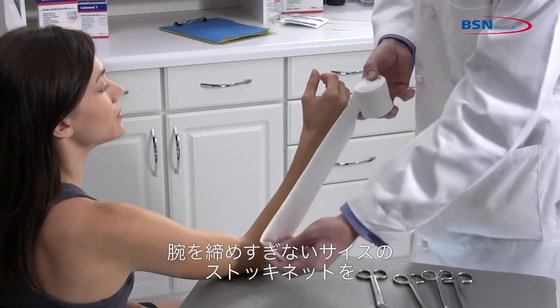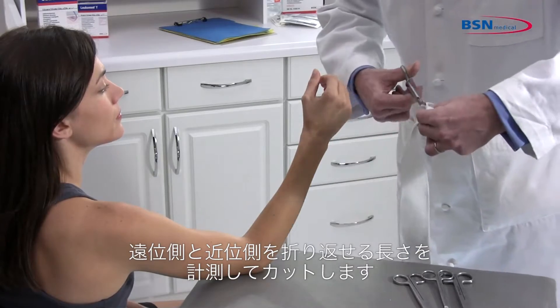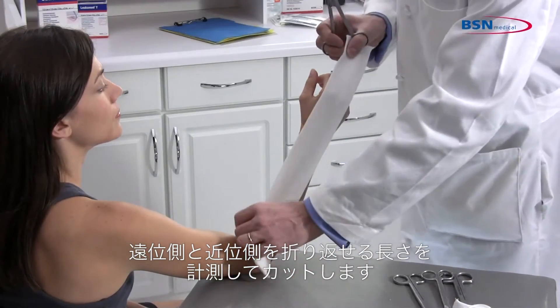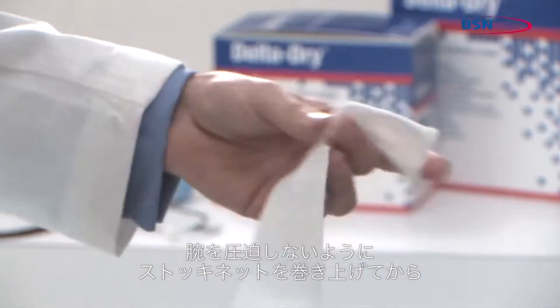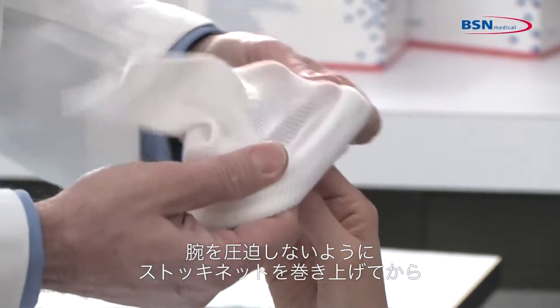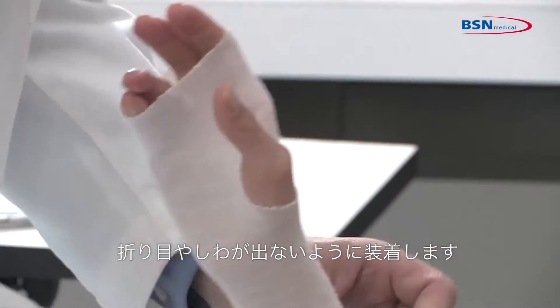Select a stockinette that will not be restrictive at the widest part of the limb. Make sure you use enough stockinette to allow foldbacks at the distal and proximal ends. Make a small cut in the stockinette for the thumb. Roll up the stockinette before applying it to the limb to lessen the pressure while applying. Roll on and remove all wrinkles and creases.